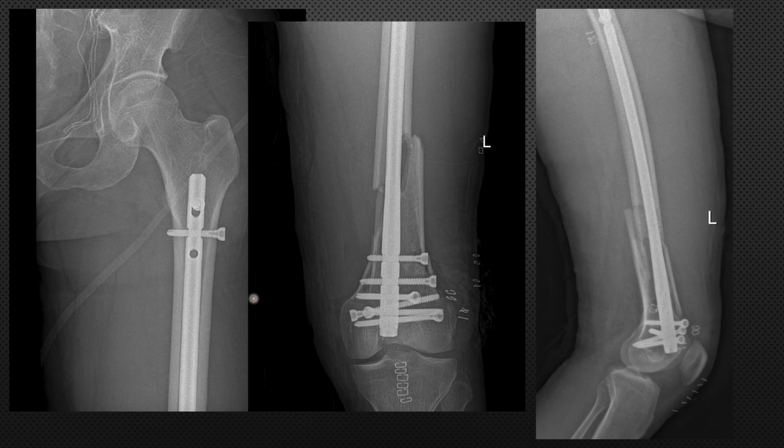So this was the post-op radiograph of this patient. You see, while the nail appears to be inserted deep in the AP view, it is just above the level of trochlea. It is not too deep. So AP view can be misleading when we are confirming whether the terminal part is coming inside the joint or not. But when we are inserting the nail through the parapatellar arthrotomy on the lateral side, in case we are going for open reduction, then definitely it is in our direct vision. So that should not be a problem. But when we are going through the patellar tendon area, it is definitely going to be a problem, and you have to ensure that the lateral view is perfect.